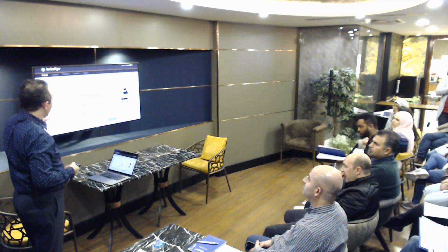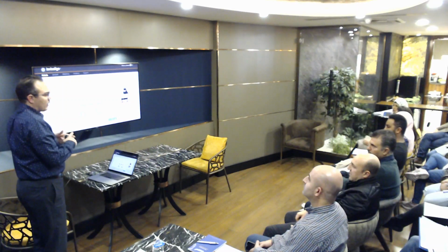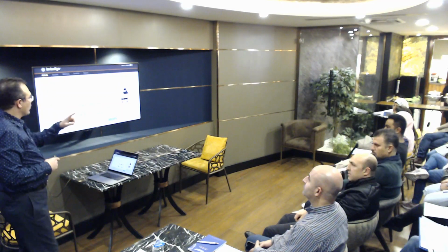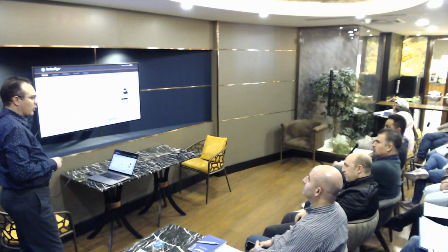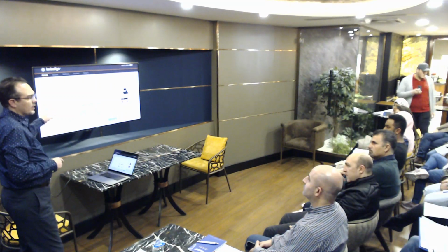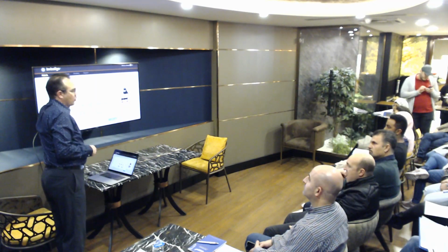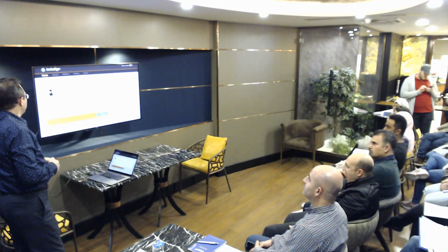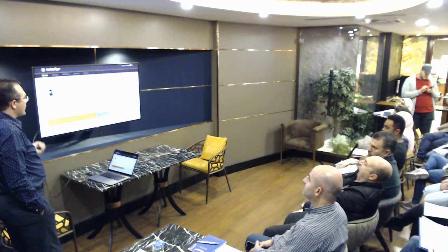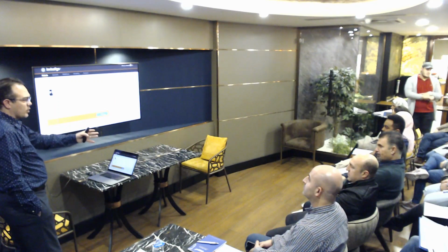And then when we come to this part of the submission, this is where you connect your scan to the case you are working with. The cases that we scanned are already uploaded to the Sirona. Hopefully they're going to be ready now. And then they will match the first name or the last name, and if it's available, they'll bring it. In case we are not using that, you are using PVS impressions, you choose that one. And then we start filling the questionnaire or the submission form. It's just a series of questions on your case and how you want to deal with it. So you give them some guidelines to start with.